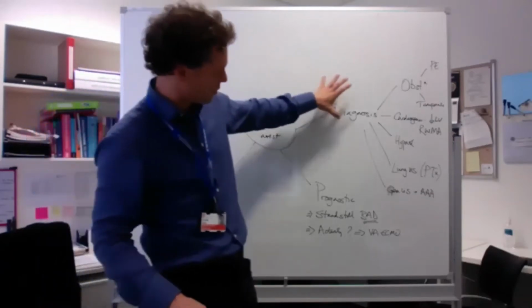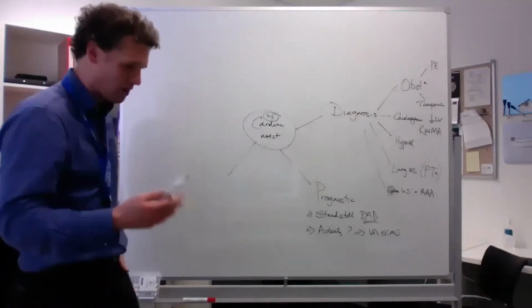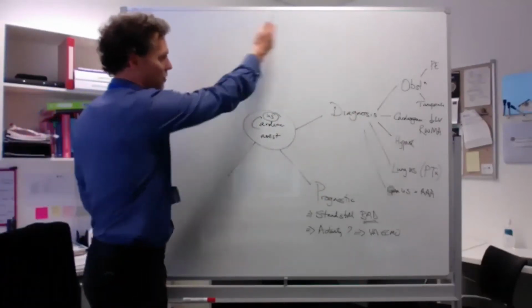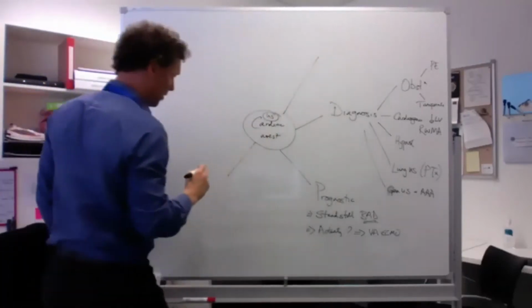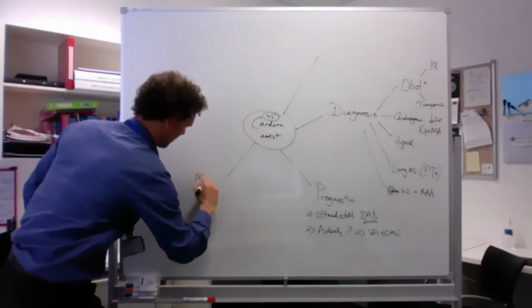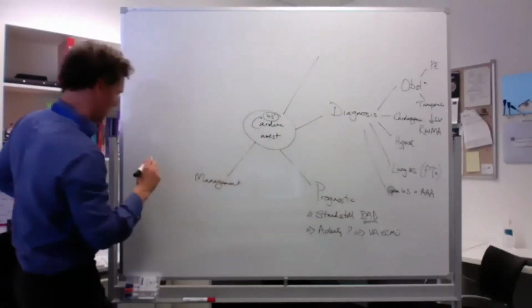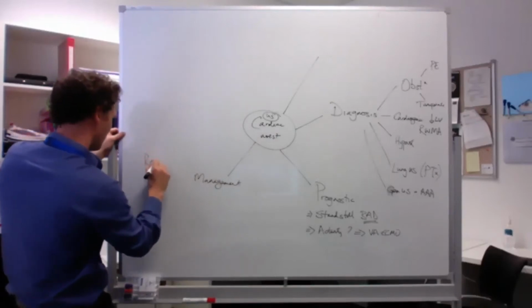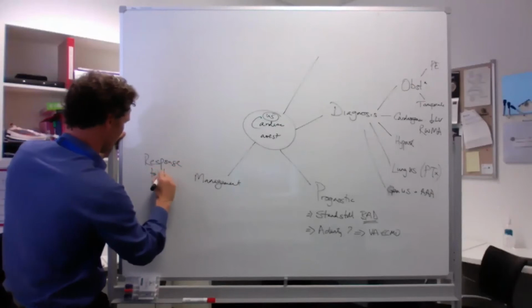Again, diagnosis. We can use it for prognostic. Or management. So you can use it to guide your management. You can see the response to filling. You can see the response to pericardiocentesis. So we get a response to treatment.